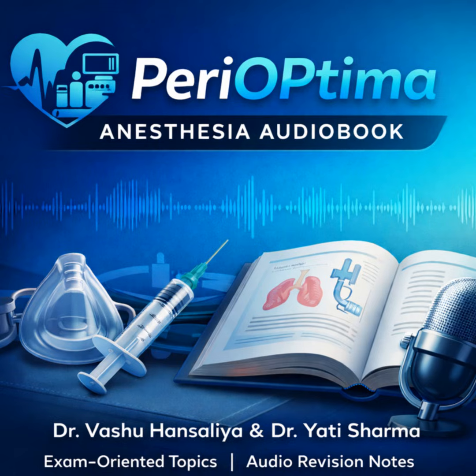Okay, let's consolidate this into the 12 absolute must-know facts for your exam flashcards. 1. Laryngoscopy's goal is glottis visualization to aid intubation. 2. The history goes from Kirstein's DL in 1895 to Pacey's VL Glidescope in 2001. 3. DL needs the sniffing position. VL works without mandatory axis alignment. 4. Macintosh is curved using the vallecula. Miller is straight for a direct epiglottis lift. 5. The McCoy blade has an articulated tip to reduce force and dental risk.